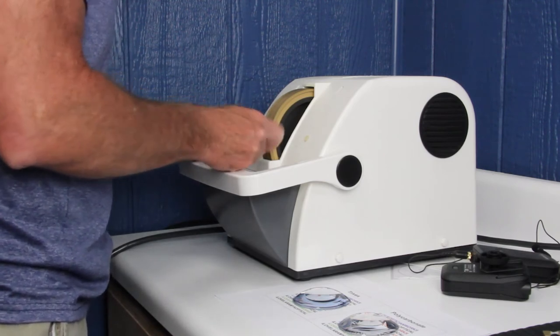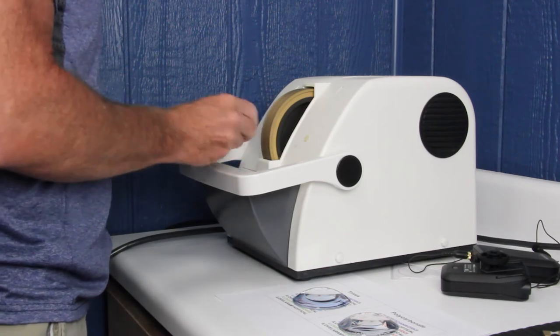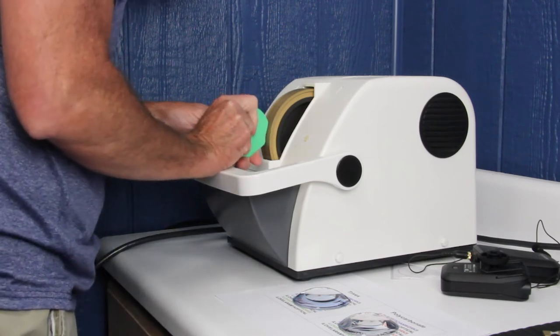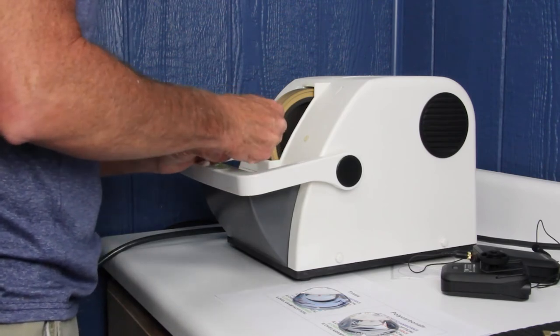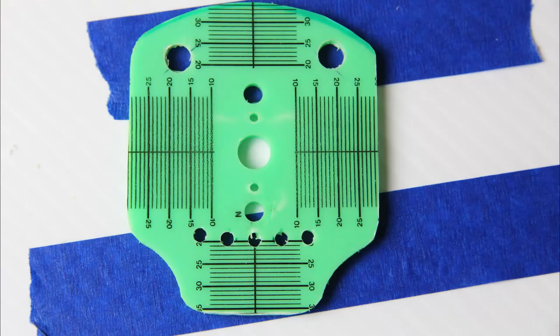Crucial: if you have a hand stone and you're working with a pattern, by all means do this. Keep feeling the edge with your finger. Even the slightest little bump will show up in your final product. When all is said and done, after some trial and error, some experimentation, trying the pattern in the edger, this is what I actually ended up with.